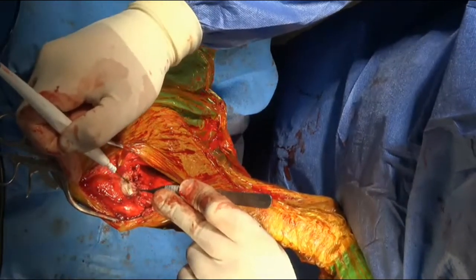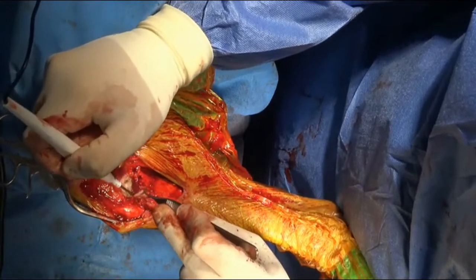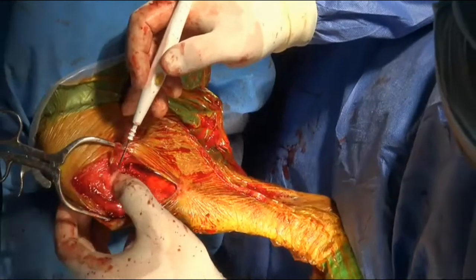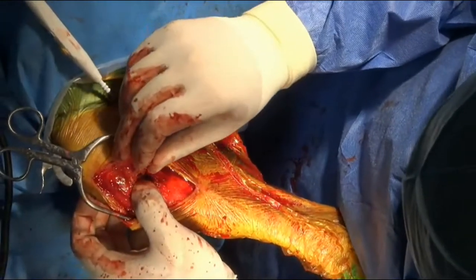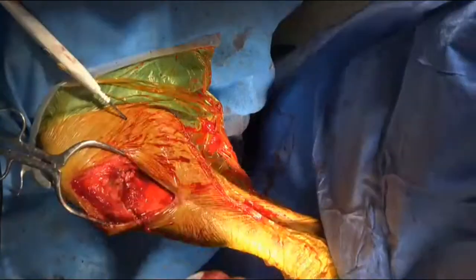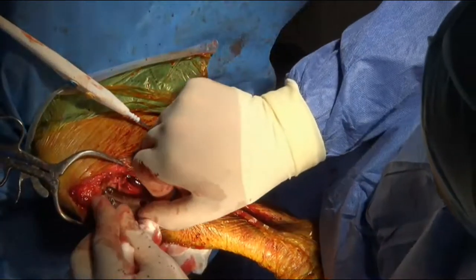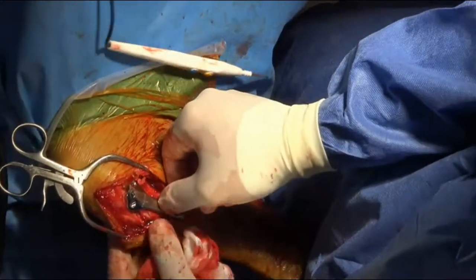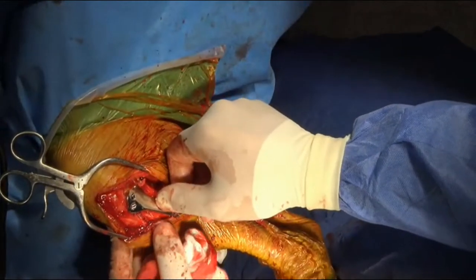Do this cranial to the collateral? Yeah, definitely cranial to the collateral. Oops. Okay. More often than not, that's enough to get it sitting down there. You can probably concur that that's sitting a lot better now.